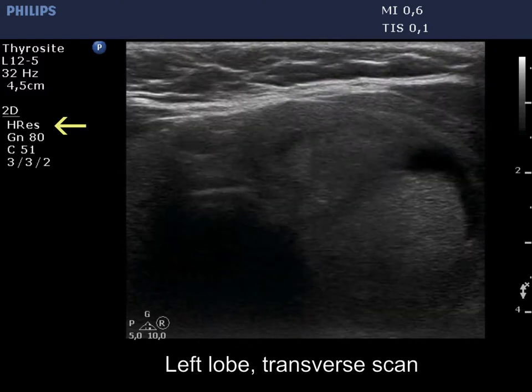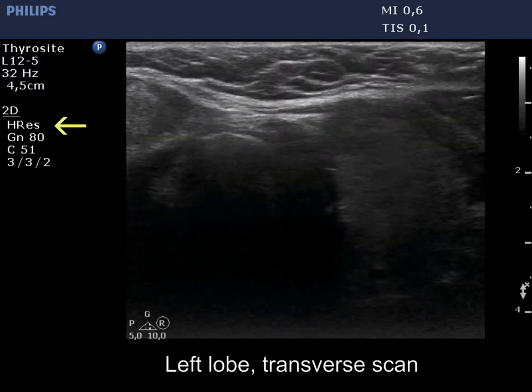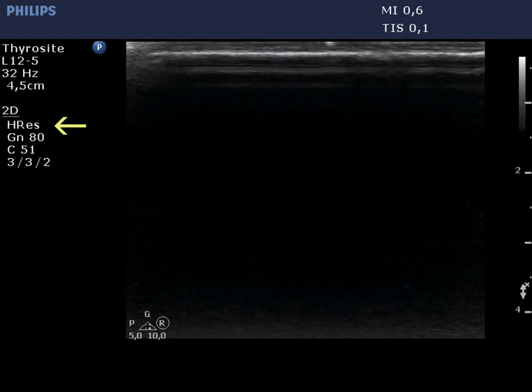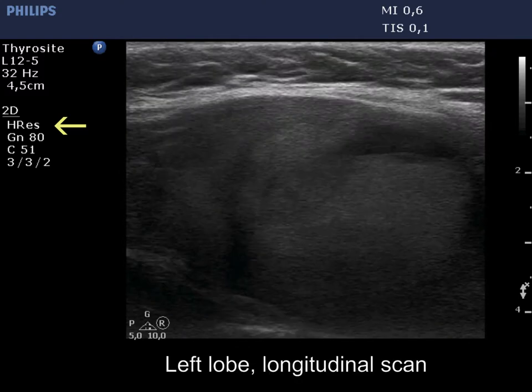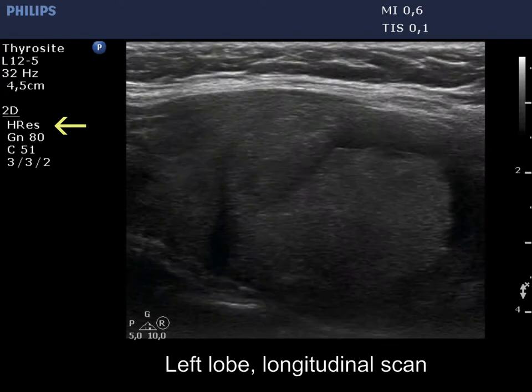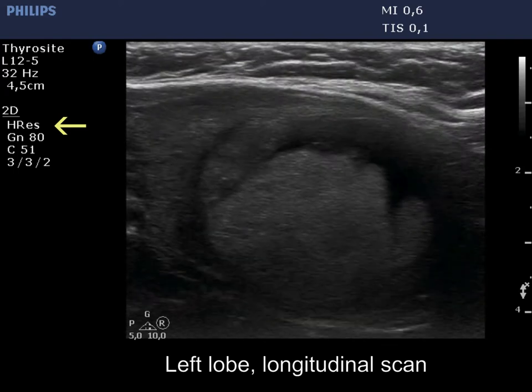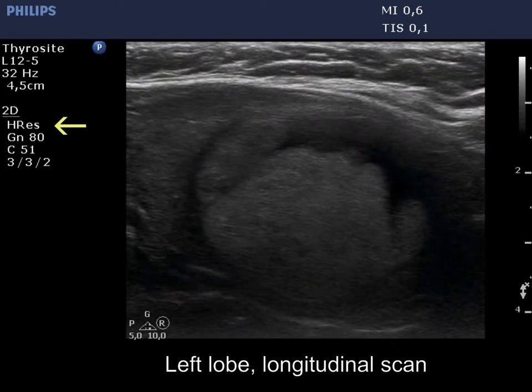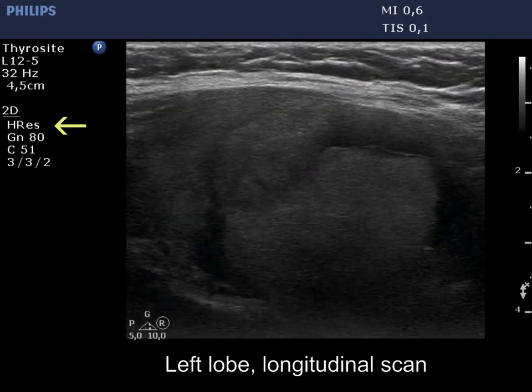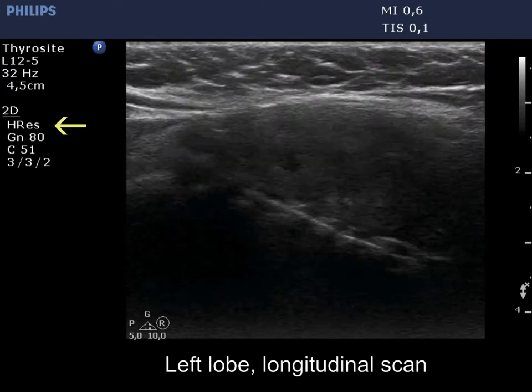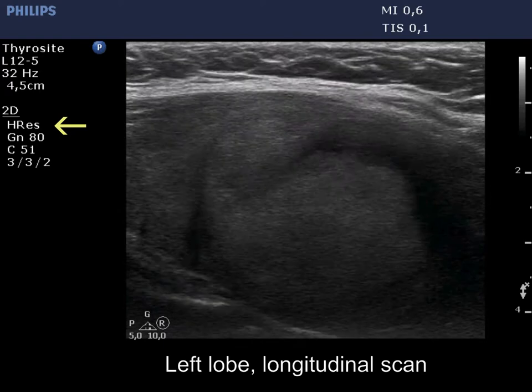First, we present the left lobe with the best resolution. The dorsal and lower part cannot be properly visualized with this setting.